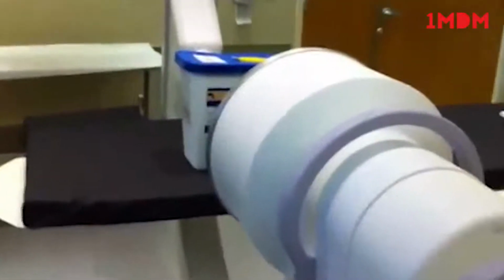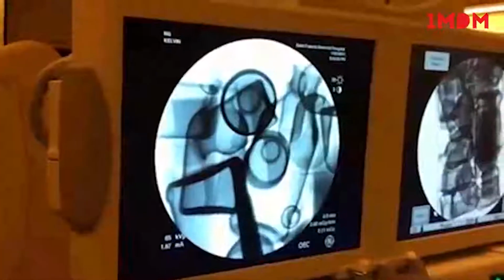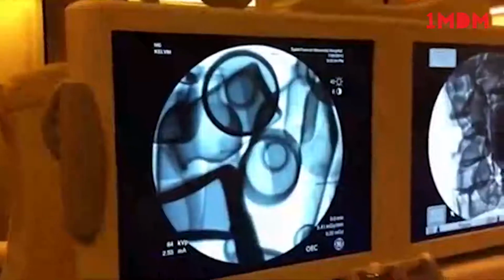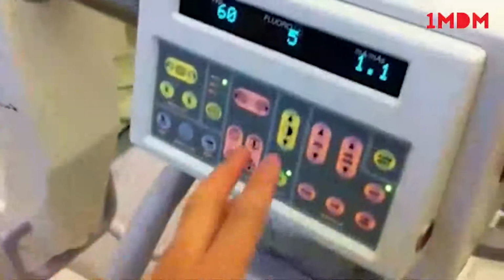This is magnification. This is now magging up one step, reducing the scan size of the eye here. All right, let's take a look at that. Why not? Now it's magnified. Hence the dose actually went up as a result. One more step. Even more. Now to take off the mag. No mag.